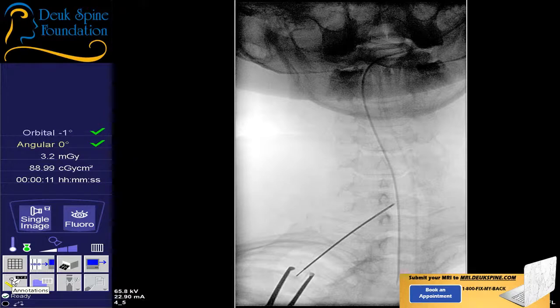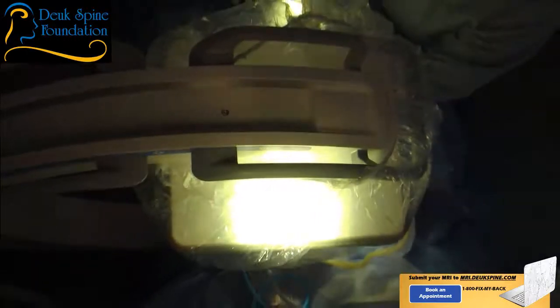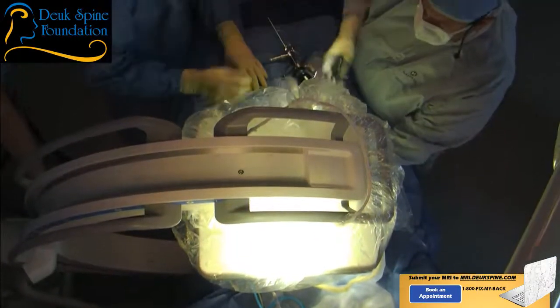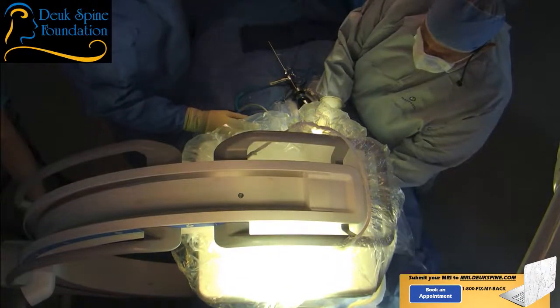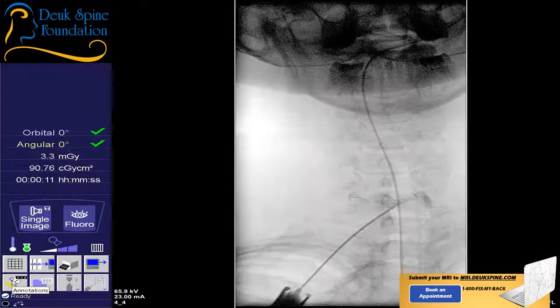I'm going to go ahead and do my discogram. I'll need the coker back. Just wait, guys, wait. So we're going to inject a little bit of dye so we can outline the herniation. Shot. There it is. You can see the dye going off to the patient's left, going around the nerve root. It's actually on both sides. There's tears, but the big one is on the patient's left. That's where the big herniation is.